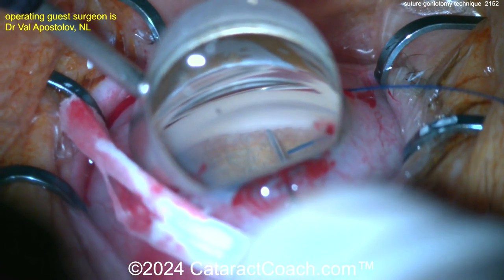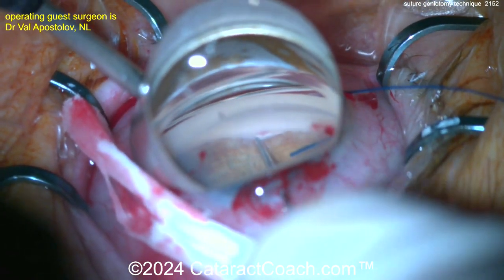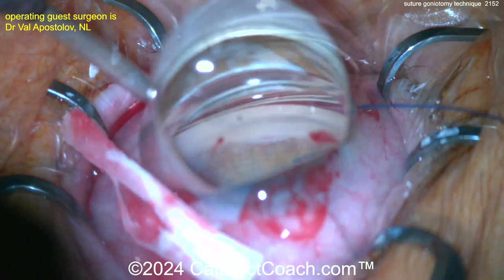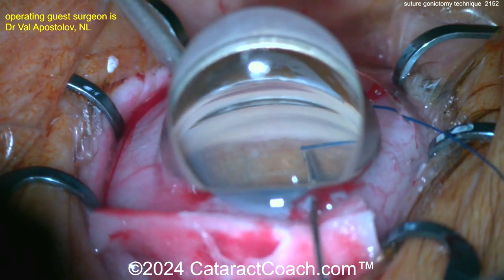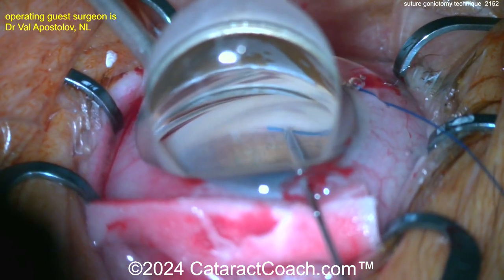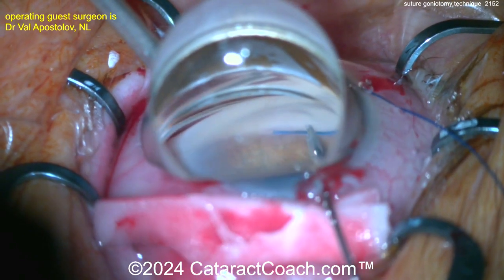It's important to cut the end of that 5-0 prolene suture so it's not too sharp. Some people even like to use a low-temp cautery to blunt the end a little bit. It's important as you pass it that it goes very easily without much resistance — you don't want a sharp end creating a false passage as you try to pass this.